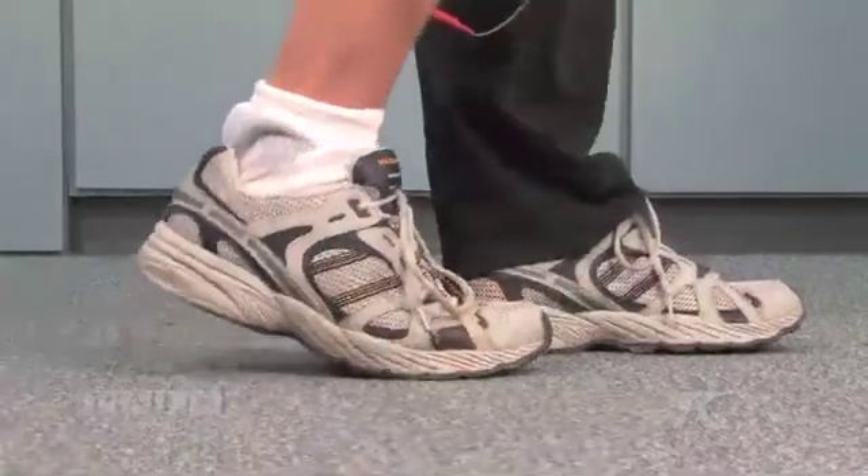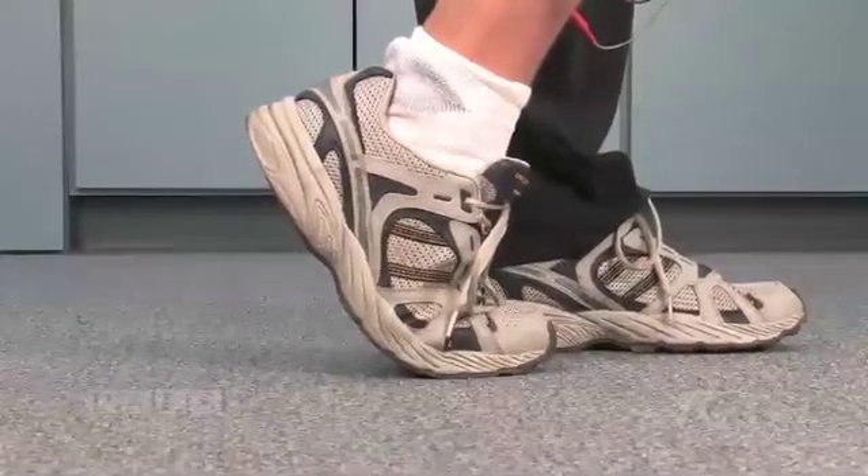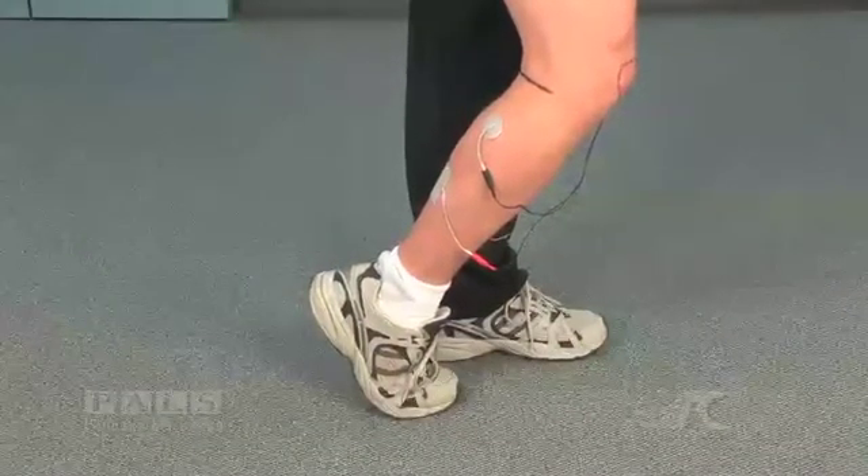During stimulation, the extremity is slightly unweighted with the opposite foot placed forward. Activation of the gastroc results in heel rise with knee flexion.